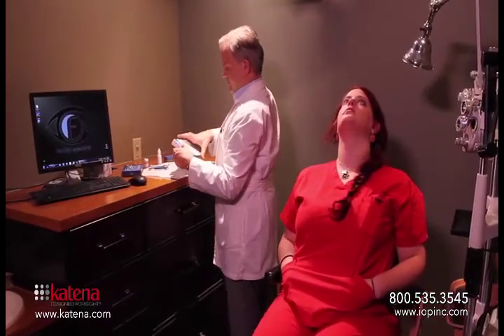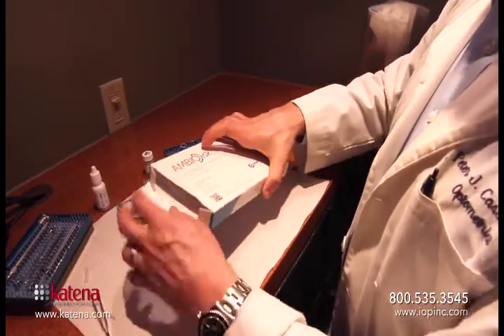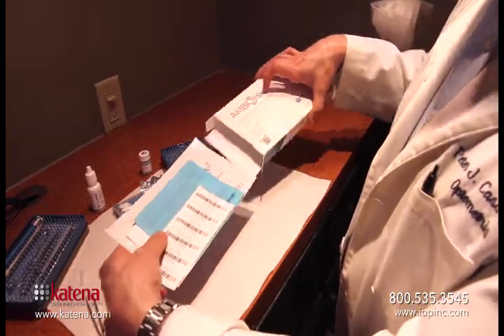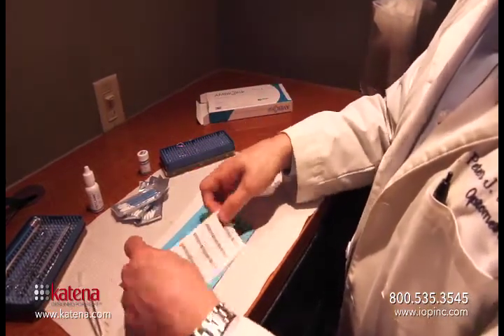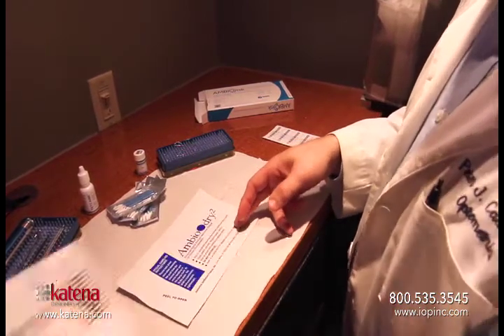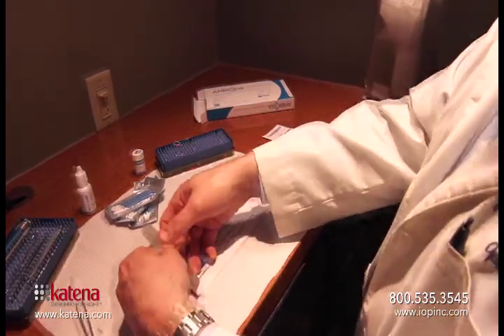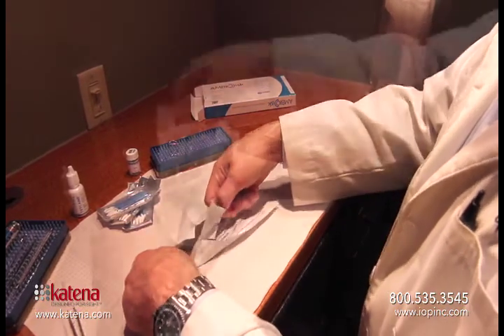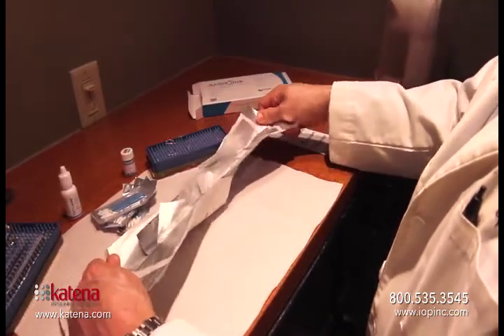Here you can see us opening the AmbioDisc packaging and you'll see several items in the package. There are barcodes that you can attach to your chart, a donor card that you'll need to send in, and then of course the tissue itself. You can see we'll open the outer package which seals and protects it, and then inside the outer package there's an inner package that has the disc itself in there.